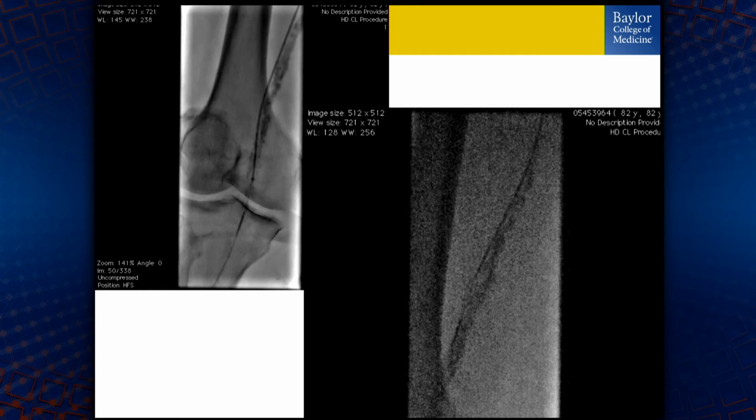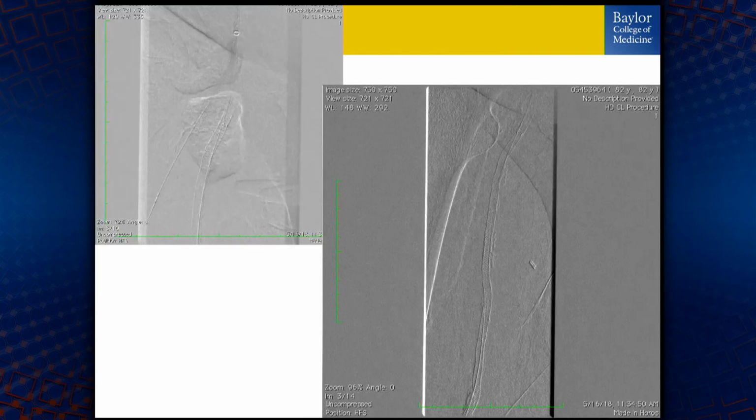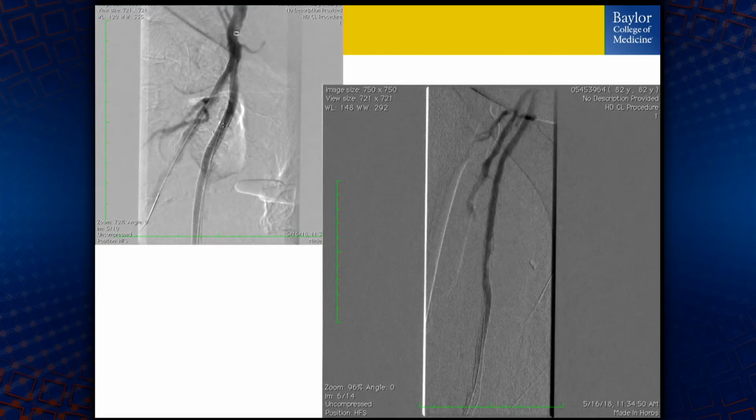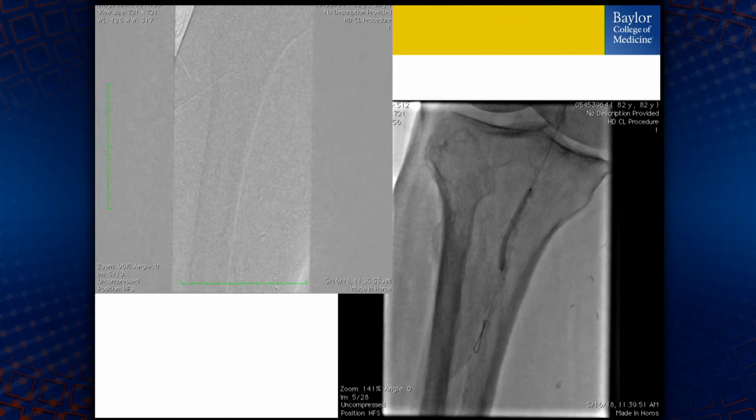Once you have your rail and you have that patient flossed with a 300 centimeter wire, then you can pre-dilate aggressively to the point that you even rupture the adventitial space and then put a scaffold into that. That's a deployment of a Supera into a very calcified segment of the artery. And as you see at the very end, a very nice recovery of an SFA all the way down with the access site still viewed on that segment.